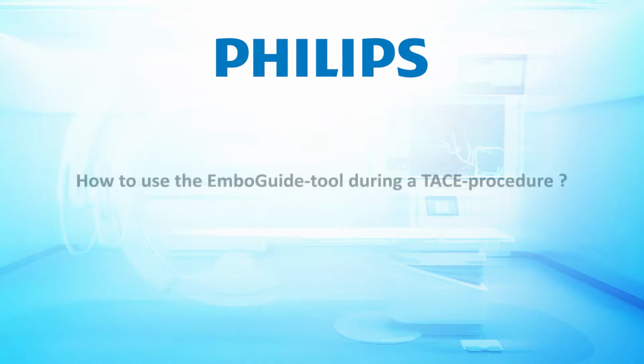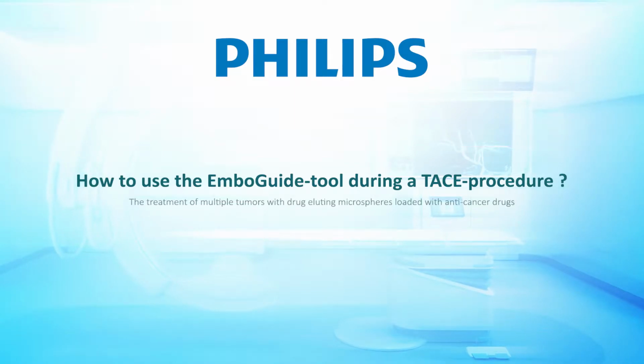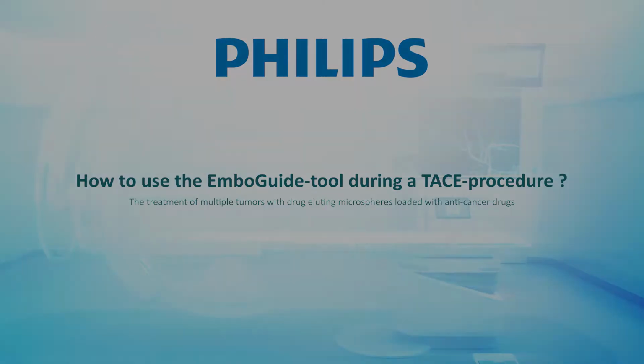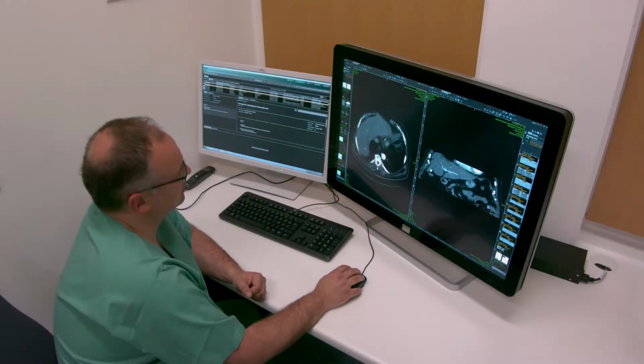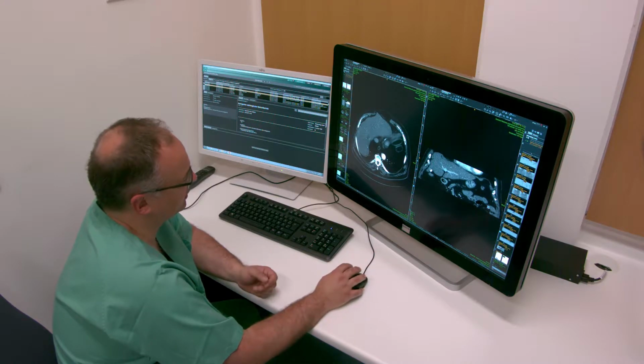This video will show you how to use the emboguide tool during a TACE procedure. In this TACE procedure, several tumors will be treated with drug-eluting microspheres, loaded with anti-cancer drugs. First, the physician will look at the pre-procedural CT images to see where the tumors are located.